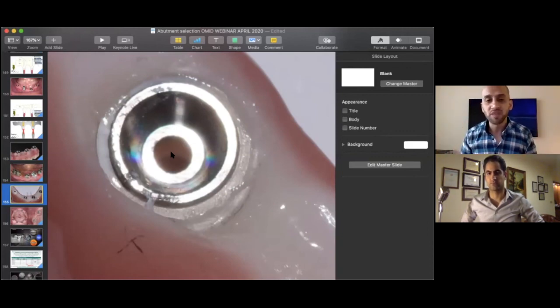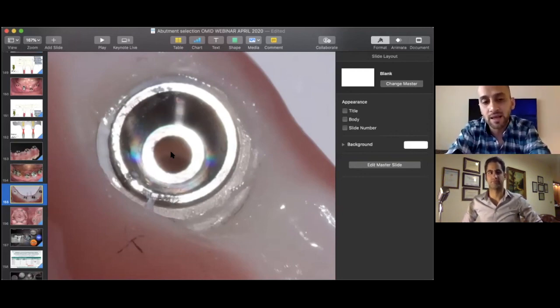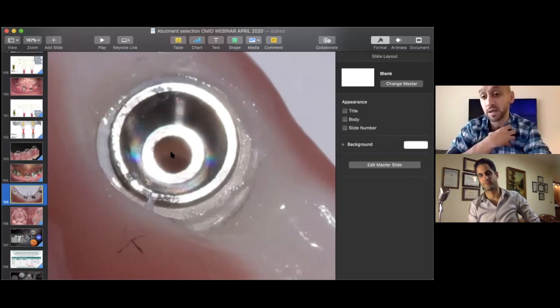But with the passive abutment, whether you have an all-on-four, all-on-eight, all-on-six, segmental, not segmental, you're going to have the same 2 micron fit every time. You can achieve that predictably, where you can't do that otherwise without the passive abutment, for me. But that's just preference.